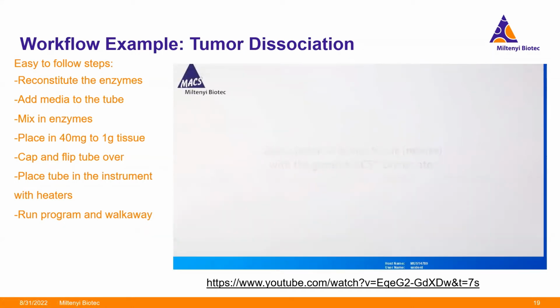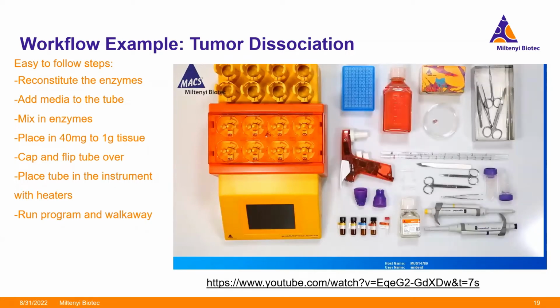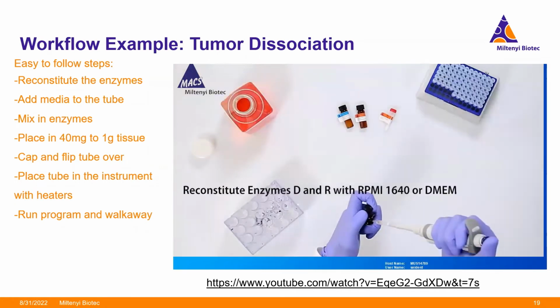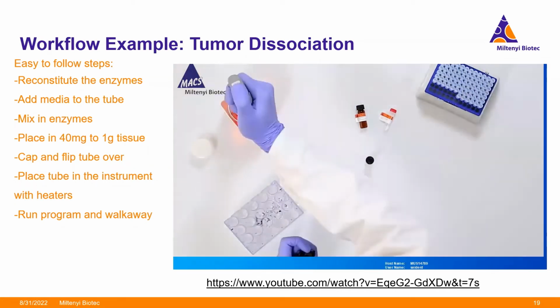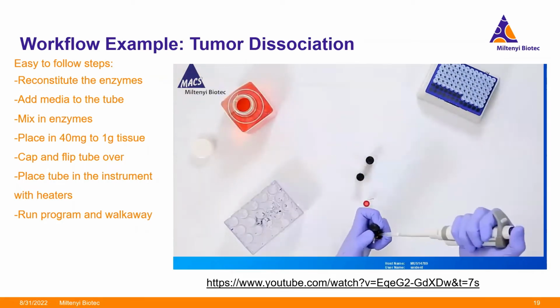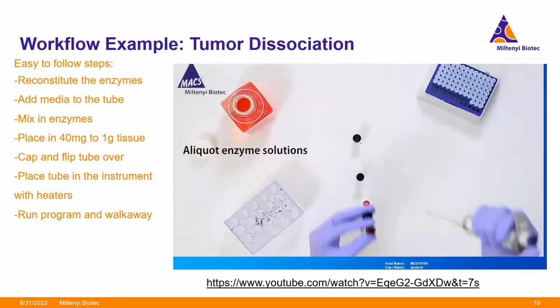All right, so this is just a quick video. It's showing you some of the materials here, and there's not really anything extra that you need, just items that you have every day in the lab. Quick summary of what's happening. Basically, you first reconstitute the enzymes that come with the tissue dissociation kit, and any unused reagents here can be stored up to 6 months at -20.